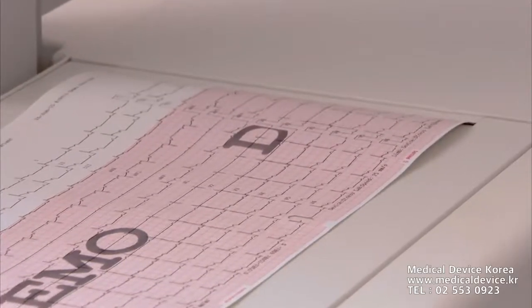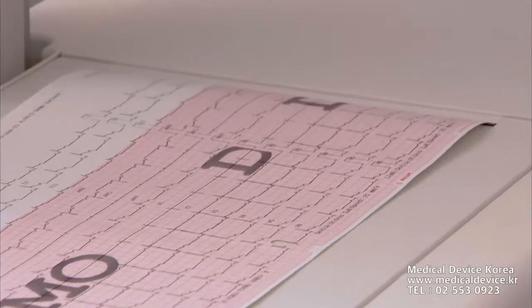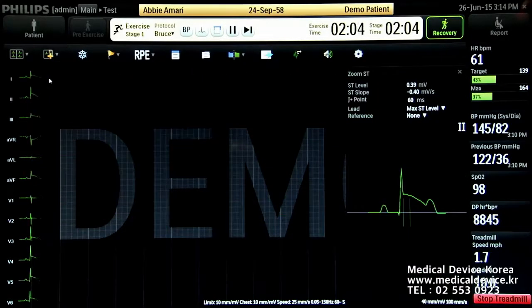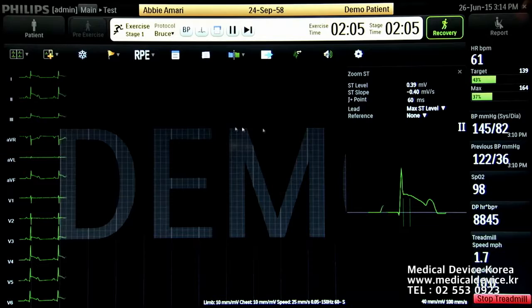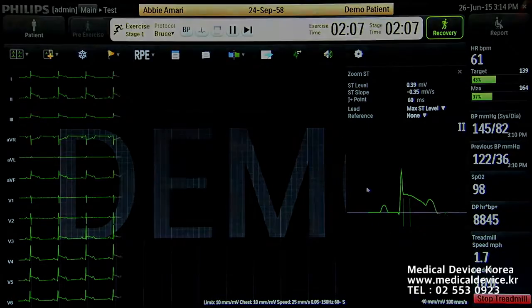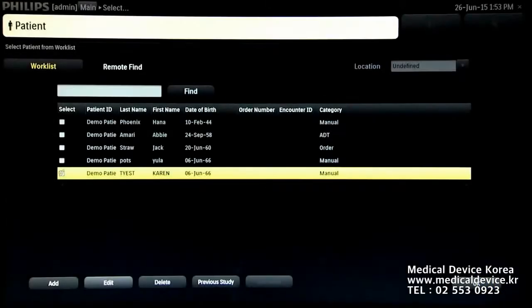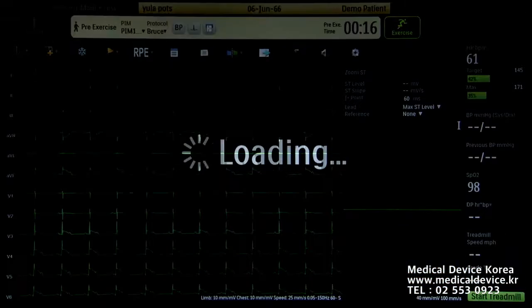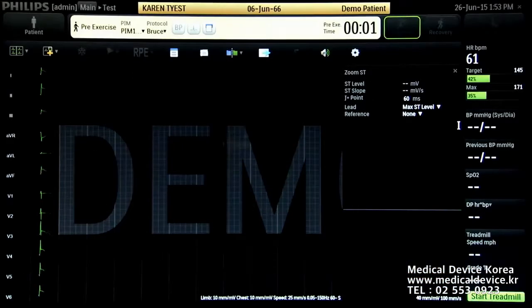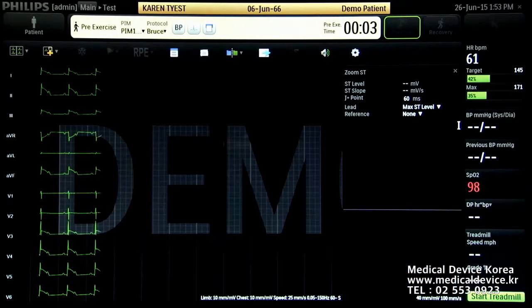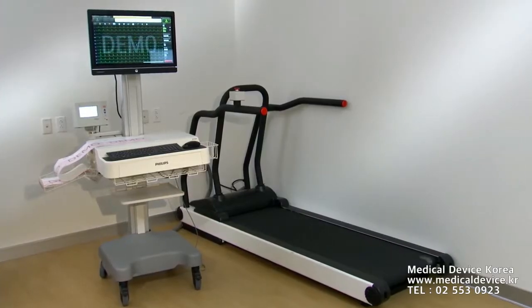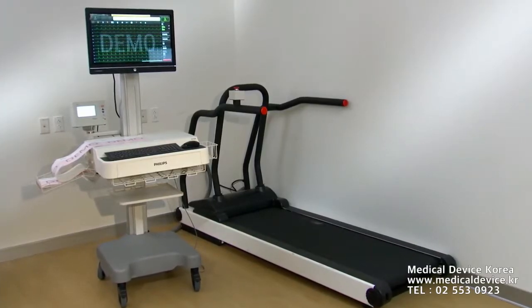For the ST-ADI, it is the same as the paper used on the cardiographs. It provides quick, easy access to previous stress tests, and auto-populates patient demographics and patient work list, ADT orders, if you purchase the IntelliBridge Enterprise, which is an option. It also includes the ST-ADI trolley.